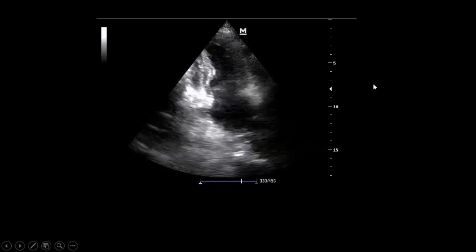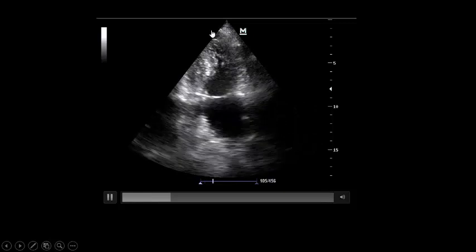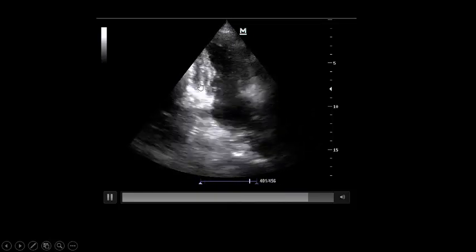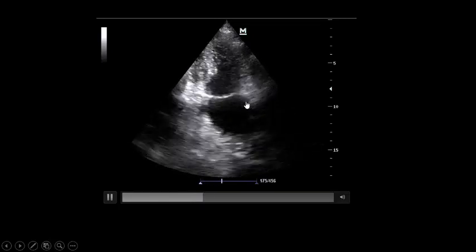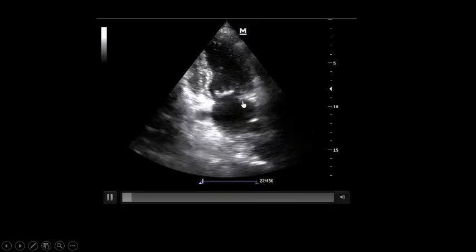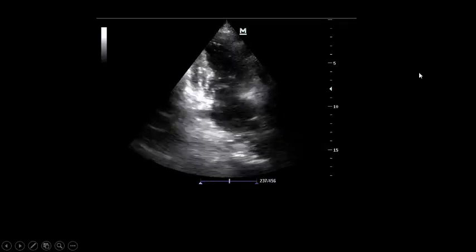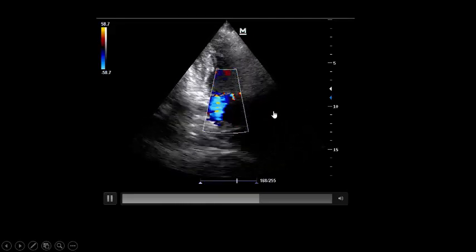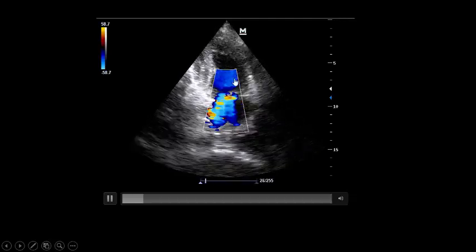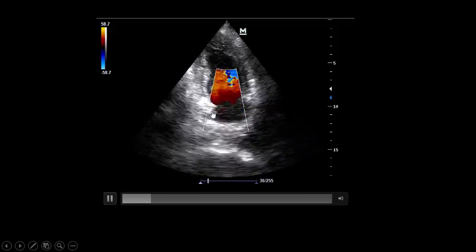If you suspect ischemic mitral regurgitation, it is better to get the two-chamber view, which clearly reveals the anterior wall contracting very well and the inferior wall, which is aneurysmal in the basal part and akinetic in the basal part. Firing color Doppler in the two-chamber view makes it very easy to assess the severity of mitral regurgitation. The regurgitation appears more severe than seen in the four-chamber view, and it goes posteriorly towards the posterior leaflet, indicating ischemic tethering of the posterior leaflet due to the inferior wall pathology, leading to this moderate ischemic mitral regurgitation.